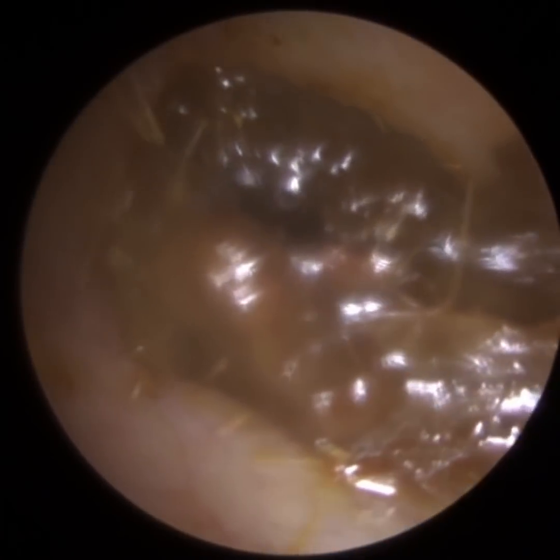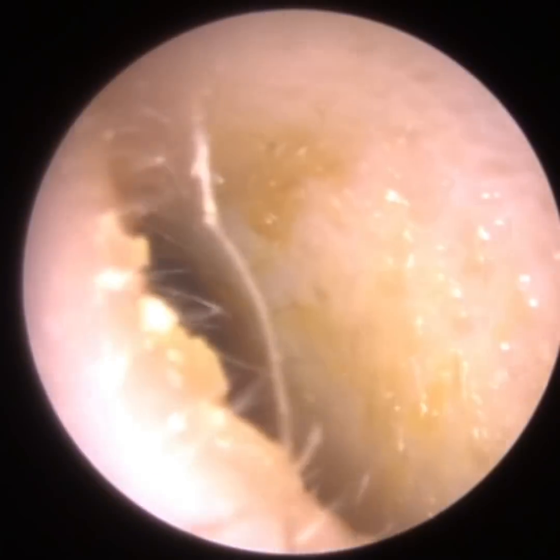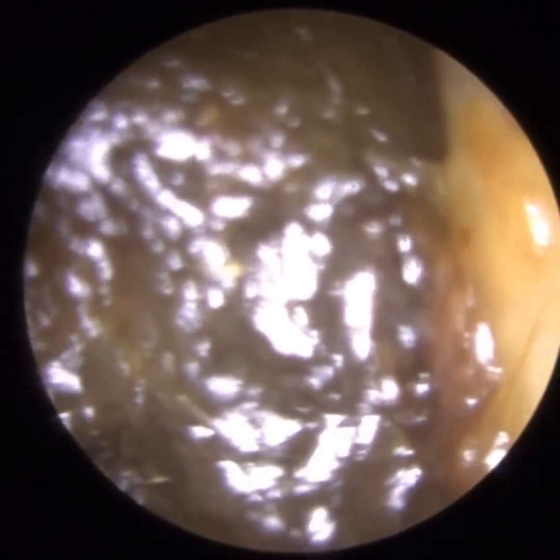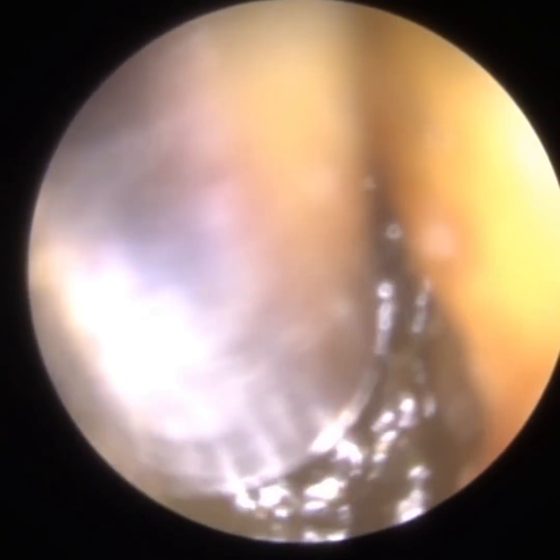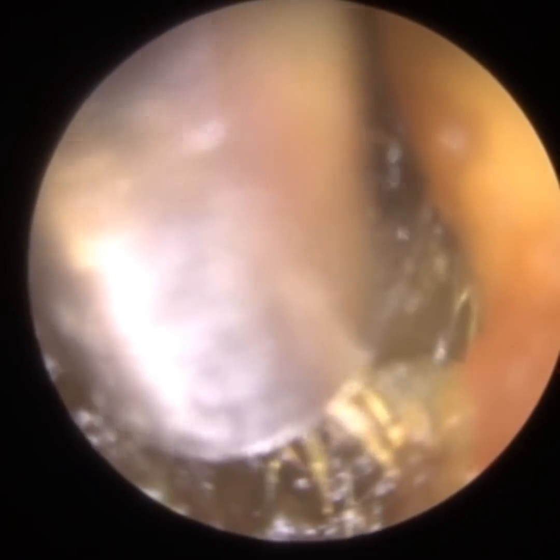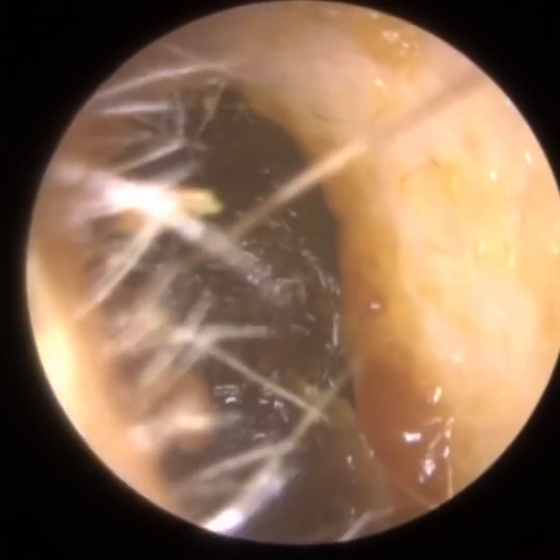It's a very interesting case of a patient who attended with bilateral blocked ears. This is the patient's right ear that we're commencing with. In this ear there's actually a lot more earwax. However, the patient felt that the hearing in the left ear was more affected, and you shall see why. The patient has got very, very narrow, twisty, bendy ear canals, so it's quite a difficult procedure for that reason.